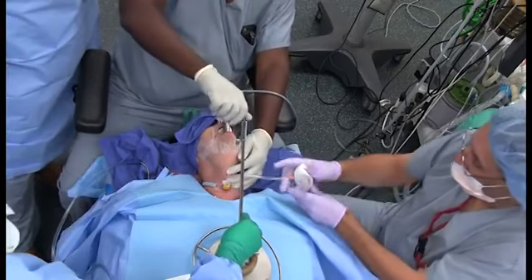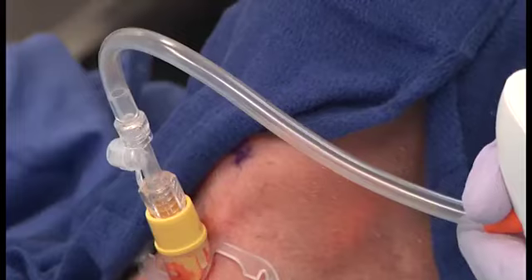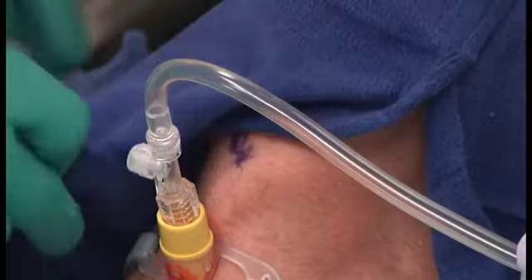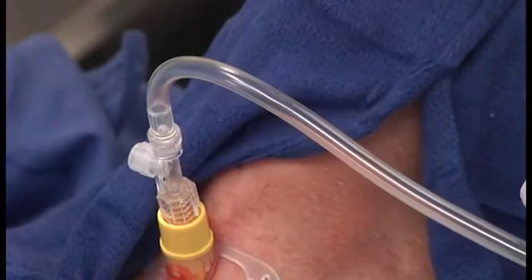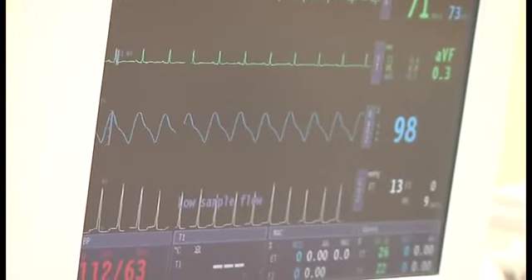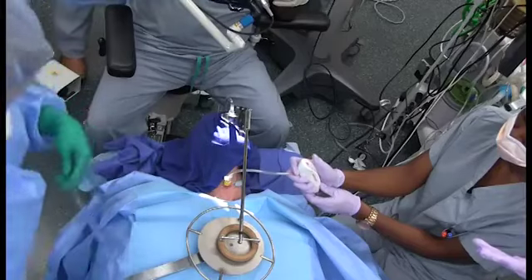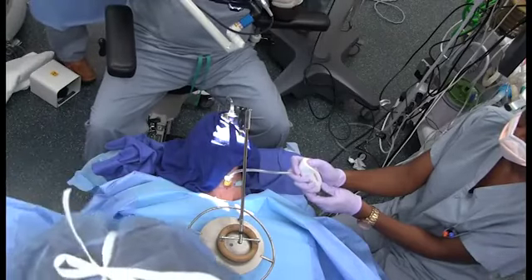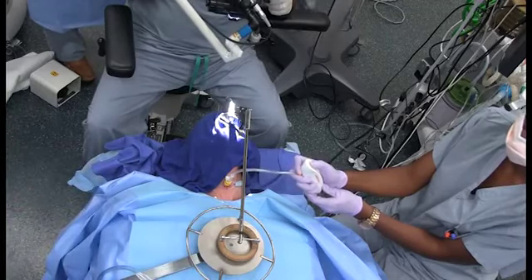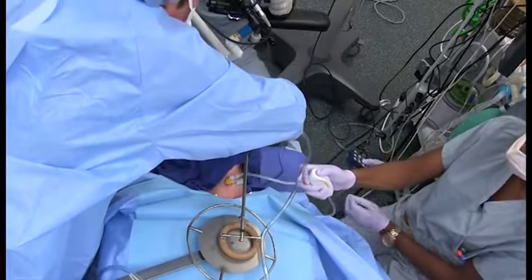During the course, adequate gas movement was monitored through subtle movements of the chest wall, misting in the VentTrain clear tubing during the expiratory phase, sustained oxyhemoglobin saturation, and a non-quantitative capnograph waveform. VentTrain oxygenation and ventilation was managed with a 1-to-1, 1-second inspiratory and expiratory phase, allowing for an equilibration phase every 5 respiratory cycles.